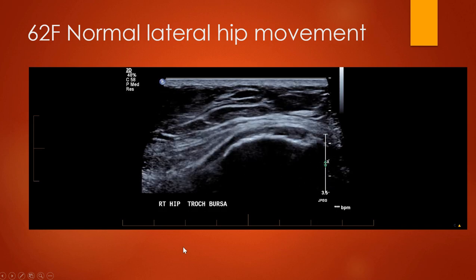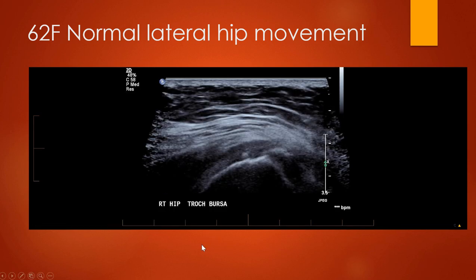So you can lie them down and move the leg forward and back as if they're doing a freestyle kick, but the hip usually needs to be adducted. So as opposed to our iliopsoas, which we abduct away from the midline of the body, to see a lateral clicking hip, you often need to adduct.